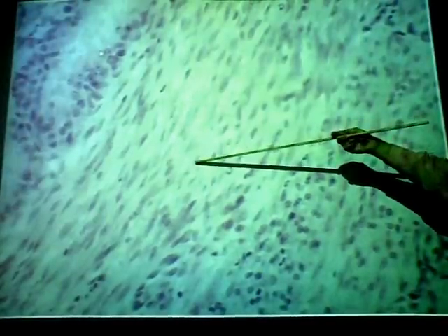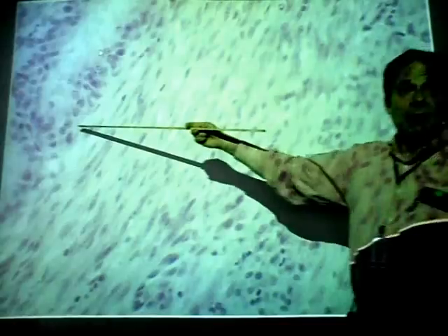There's not 3 layers? No, there's only 2 layers here. Inner layer, smooth muscle, arrangement circular. That's adjacent to the lamina propria. Outer layer, more to the outside of the wall, is the longitudinal. Just the opposite of what we saw, unfortunately, in the male tubes, epididymis and ductus deferens. Now don't ask me why it's reversed.